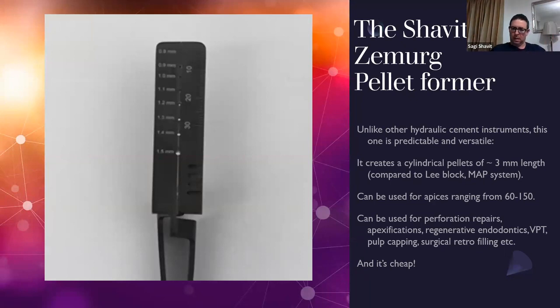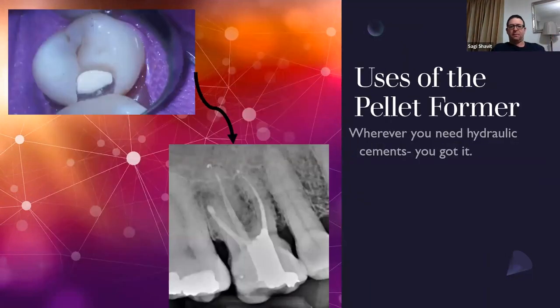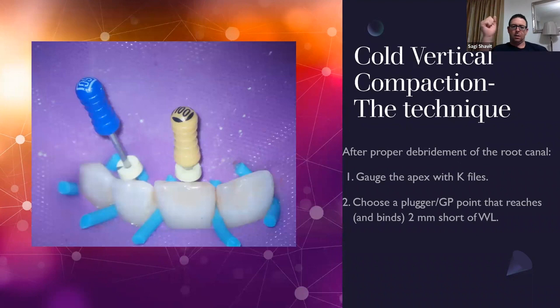All right. Now, as I said, from vital pulp therapy or pulp capping to retrofilling in surgeries, the whole variety, wherever you need a bioceramic, Biodentine, MTA, you got it. Just that instrument does them all. Now, let's have a look at the case step by step.